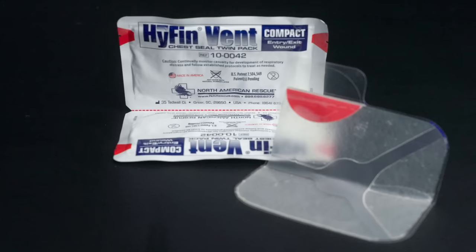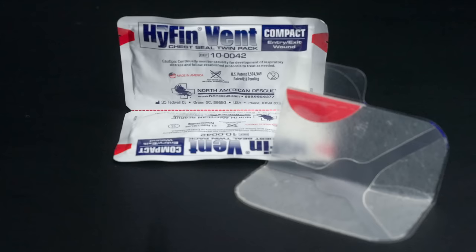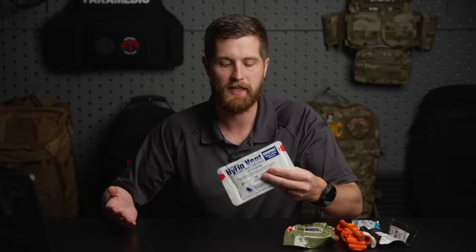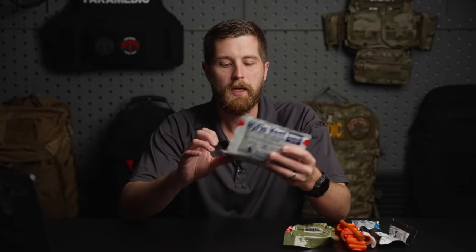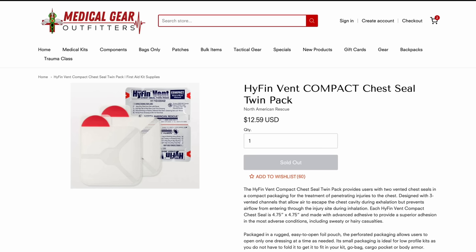Next up, we've got chest seals. I put this pretty low on the list of importance. These are Hyfin — they're a laminar valve that's been shown to be among the more effective on the market for reducing the incidence of a tension pneumothorax. That's a collapsed lung that's pushing the mediastinum over and causing obstructive shock. I like these because there's an entrance and an exit, which is pretty clearly for your gunshot victim. However, this can also be used to cover an abdominal wound and keep dirt and grime out.